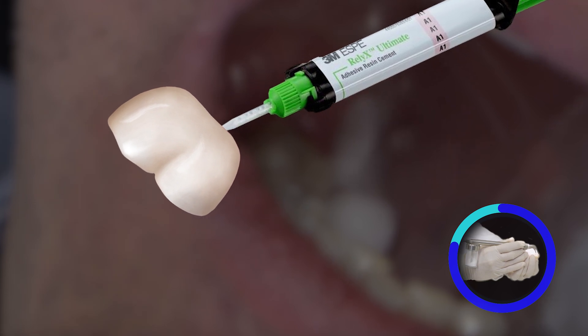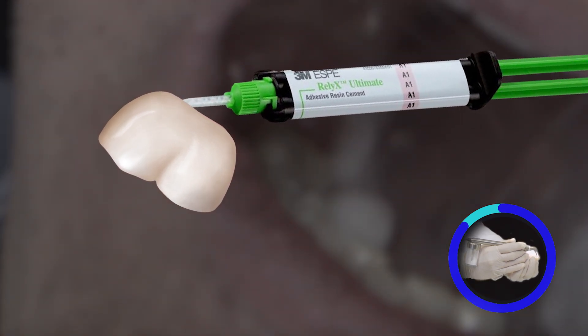We'll apply in this case our resin adhesive resin cement from 3M, which is the Reliax Ultimate. How does it feel right now? Very good. It feels very good.